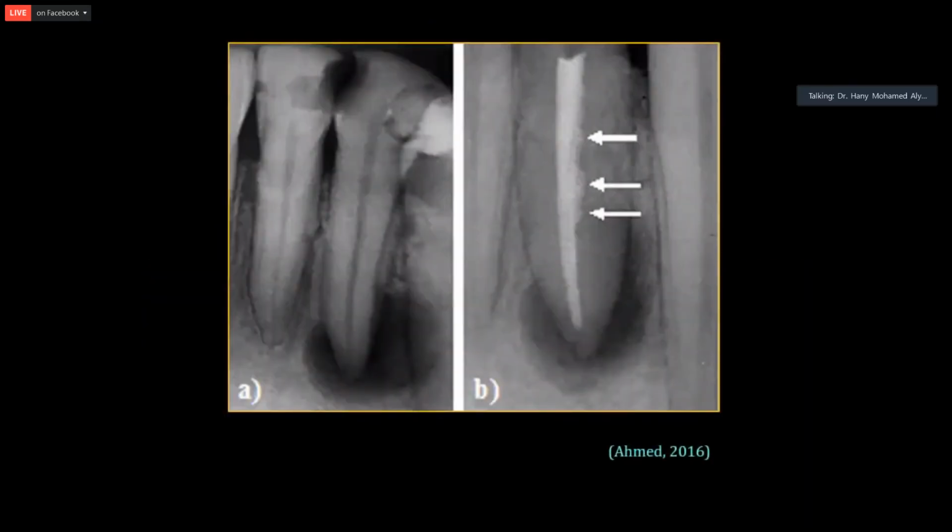So it is very important that even after you do canal obturation, you also have to observe the flow of the obturation material inside the canal. Và tiếp theo nữa là có những ca mà khi mà mình đã đến giai đoạn hàn ống tủy rồi, nhưng mà trên chụp phim X-quang lại thì mình thấy có cái sự đẩy ra của những cái phần vật liệu hàn như trên hình ấy.